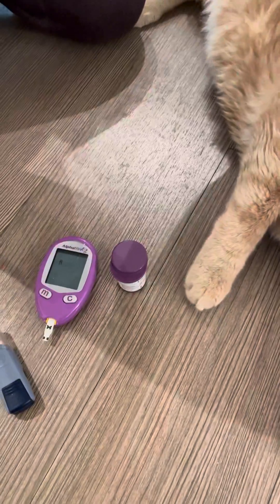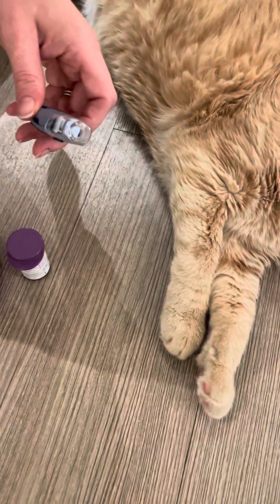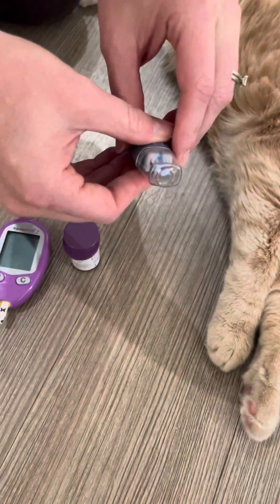After the sensor is inserted, you have 30 seconds after the first blood drop to get the sample to read. Now this is how you take his glucose on his ear.